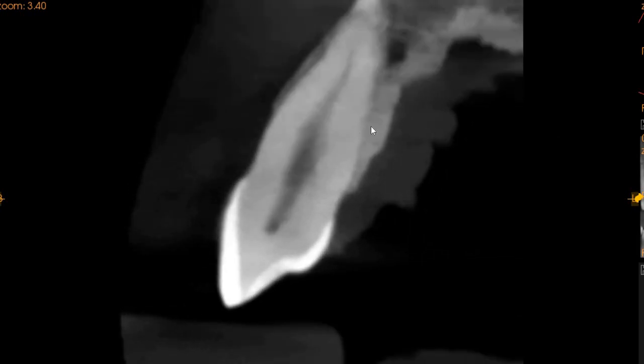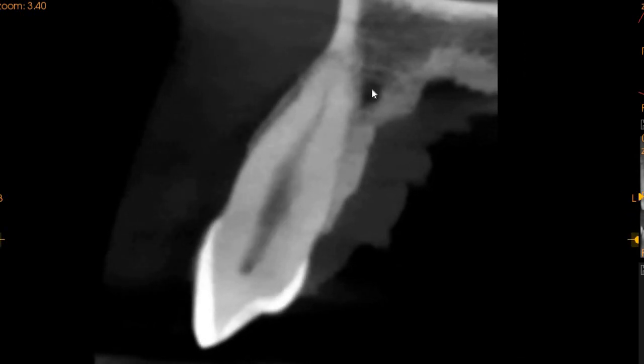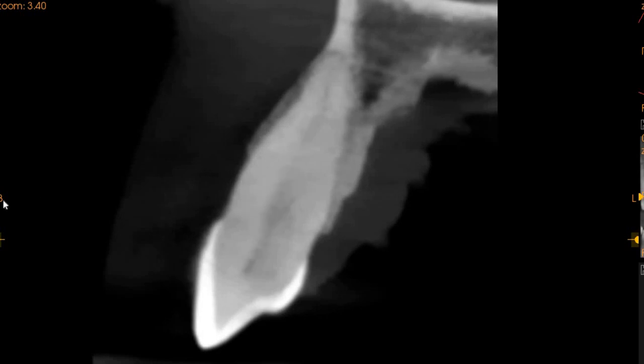We don't see any periapical pathologies, but we do see a slight radiolucent area, or a hypodense area, right next to the tooth. We don't see any cavities and we don't see any significant problems as such. But if we can highlight the working length for our kind doctor from the chamber opening area, it is approximately 20 millimeters.